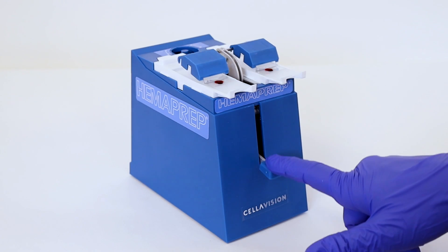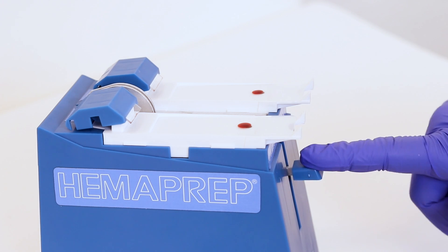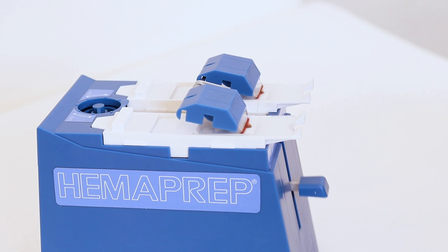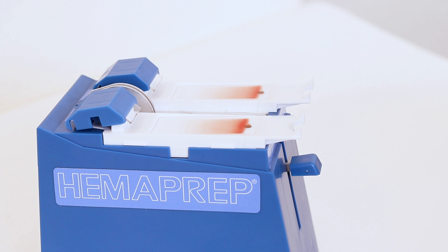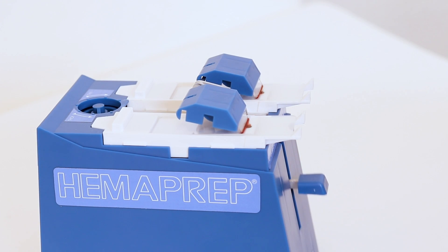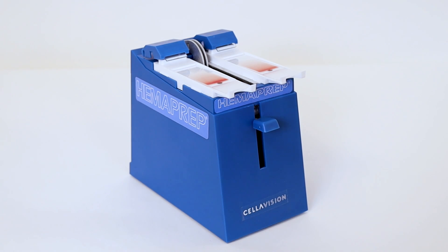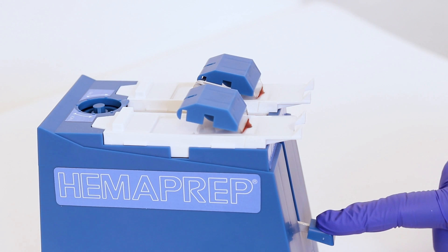Press down firmly on the plunger so that the spreader blade makes contact with the blood. Hold the plunger down for a little over one second, or the time it takes to say 1001. Release the plunger all at once and the spreader glass will spread the blood. It is very important that you hold the plunger down just for a long second.